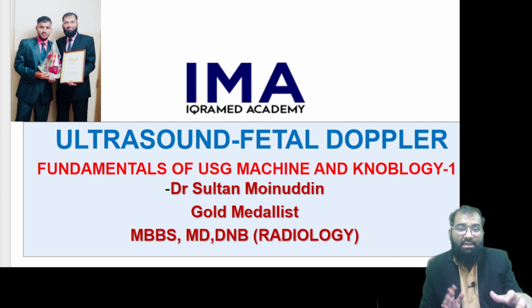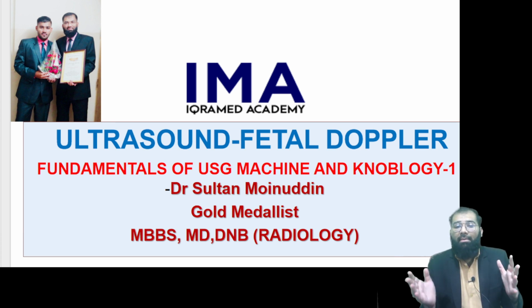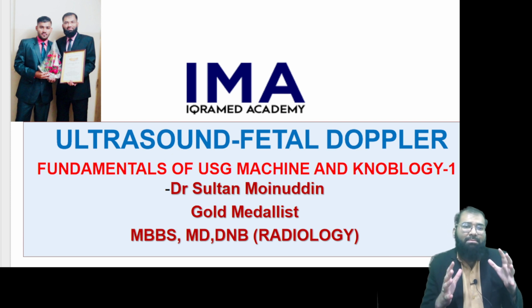So maybe you have measured that the S by D ratio is high, or you say that the umbilical artery flow is absent, but there were technical problems. You had applied a lot of pressure. It is possible that instead of measuring the uterine artery, you took it in some other vessel, which has given a raised PI of the uterine artery. So in cases of fetal MCA, there are lots of technical aspects, the physics part, which you are supposed to know when it comes to Doppler.